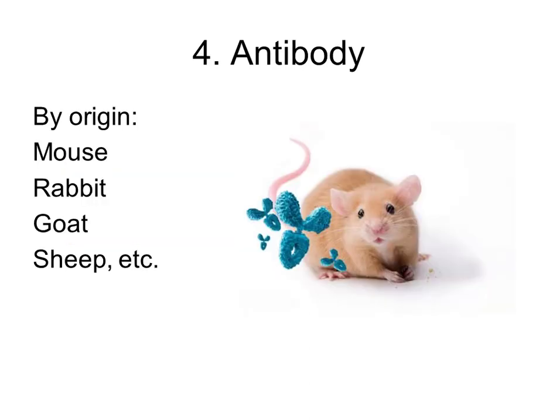Antibodies. Antibodies can be different. According to their origin, they can be mouse, rabbit, goat, sheep, and others.